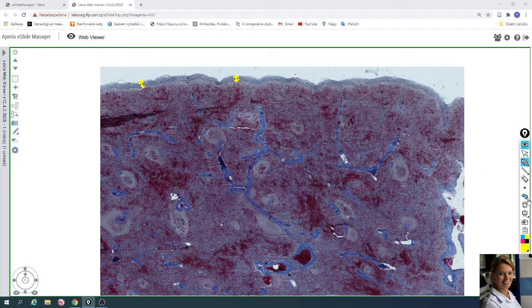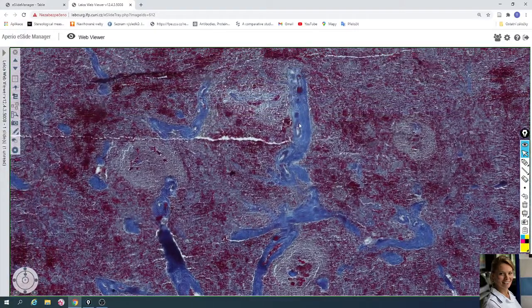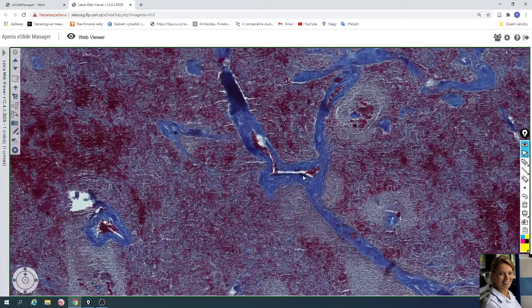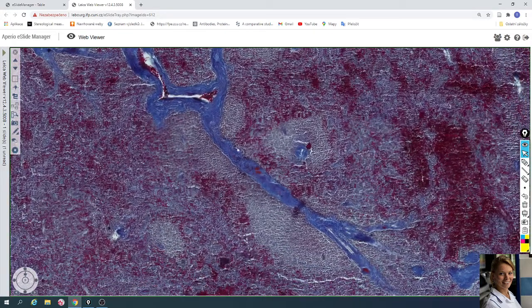The fibrous trabeculae contain blood vessels, arteries and veins. Here you can find blood vessels in the fibrous trabeculae. Here this is the fibrous trabeculae with blood vessels. The branches of the trabecular artery leave the trabecula and enter the white pulp of the spleen.